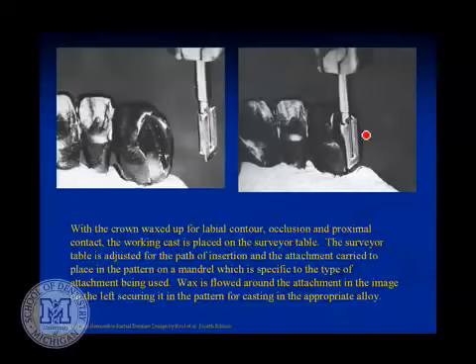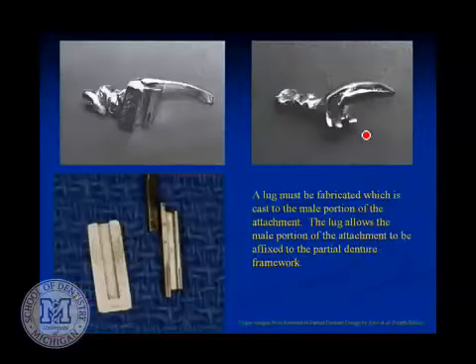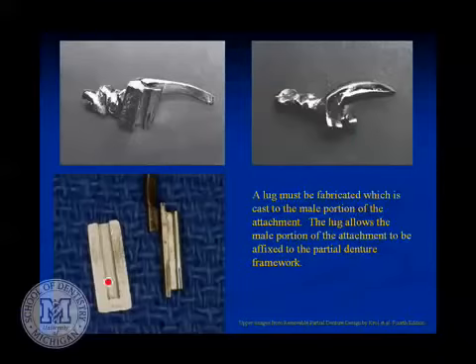Works very nicely. So these are not difficult to set. And then for the male portion, again, here was the female portion that was incorporated in the tooth. The male portion has to have some way to get hooked into the partial.